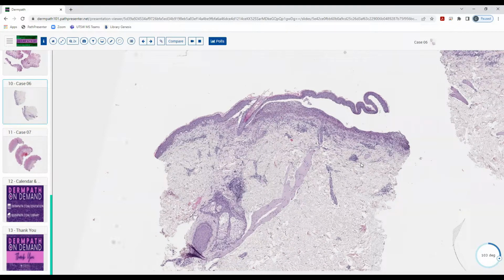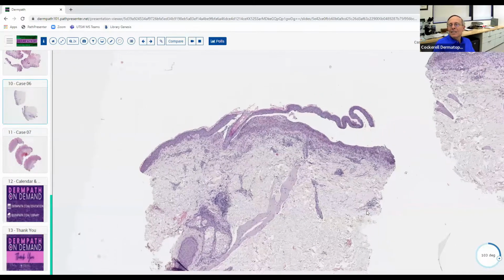I mean, I guess BP or lupus. I'd probably go with linear IgA second, because drugs and things like that can give it to you. Then you can see neutrophil-rich pemphigoid sometimes. That's relatively rare. We don't see that all that common. Bullous lupus, you don't usually get EOs in that when you do see it. So that's less common too.